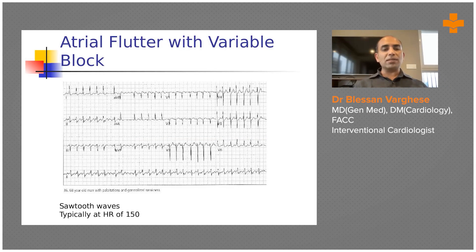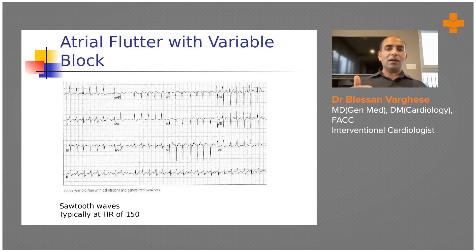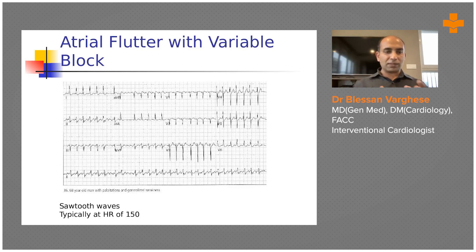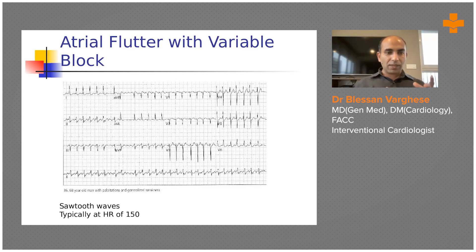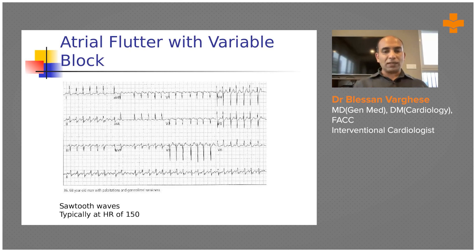This ECG shows atrial flutter with variable block. Atrial flutter is essentially a sibling of atrial fibrillation. With atrial flutter you will have more organized QRS complexes compared to atrial fibrillation, and the rate can be regular, regularly irregular, or completely irregular. The key feature is the flutter waves — unlike fibrillation waves, you can clearly delineate these sawtooth flutter waves. There are typical and atypical flutter patterns.